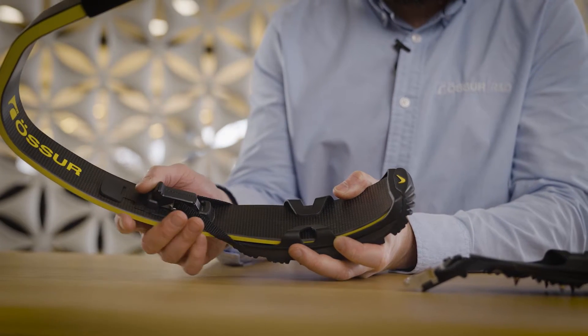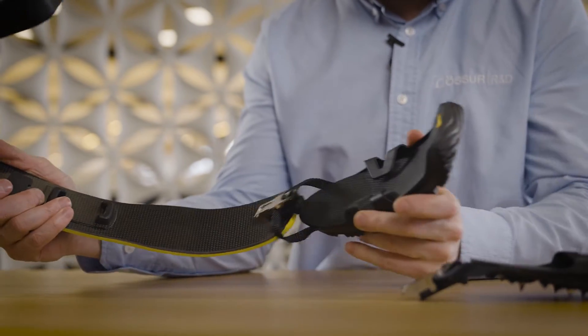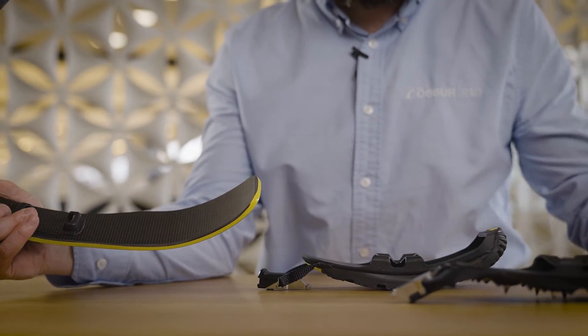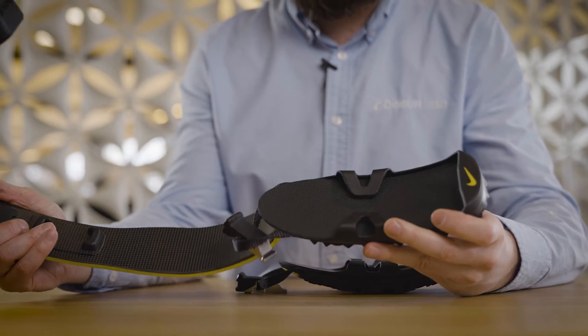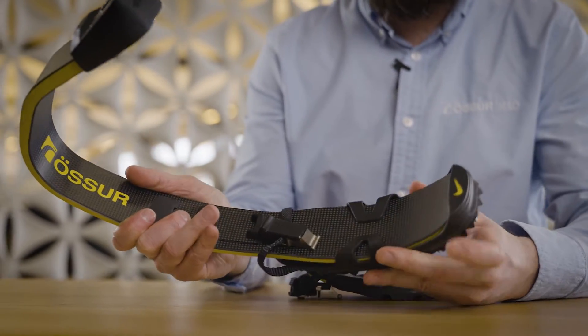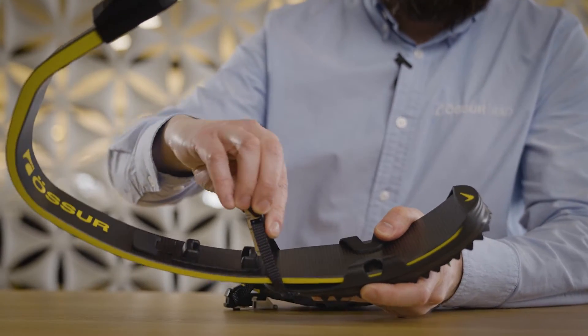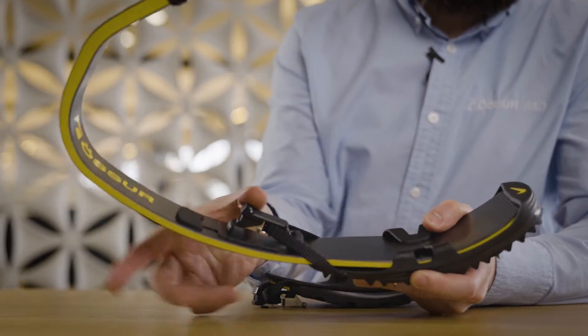As an example, we worked with the Nike Innovation Kitchen to create a new product called the Nike Traction Soul X. The Soul X is an interchangeable sole system which can be used on a running blade. This allows the user to switch between a traction sole and a spike pad with just a simple click of a button.